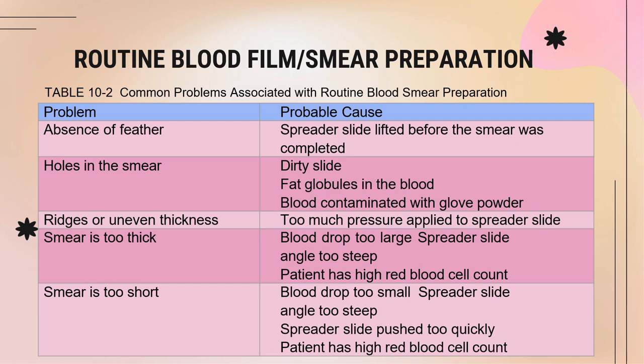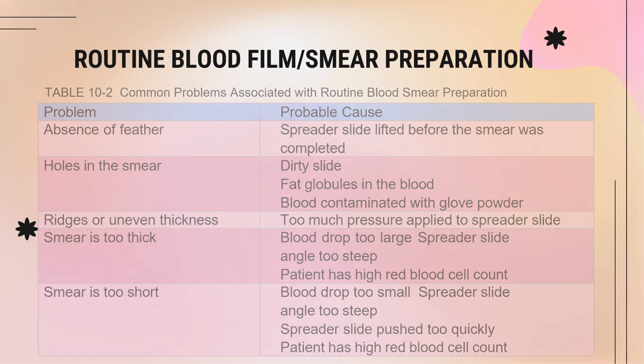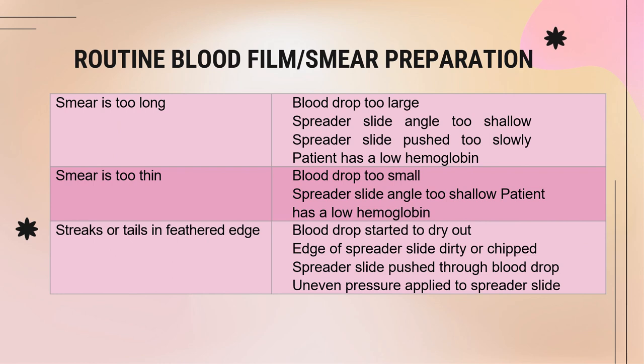Spreader slide angle too steep or too high, patient has high red blood cell count. Smear is too short: blood drop too small, spreader slide angle too steep or too high again, spreader slide pushed too quickly, patient has high red blood cell count. Smear is too long: blood drop too large, or spreader slide angle too shallow or too low, spreader slide pushed too slowly, patient has a low hemoglobin.